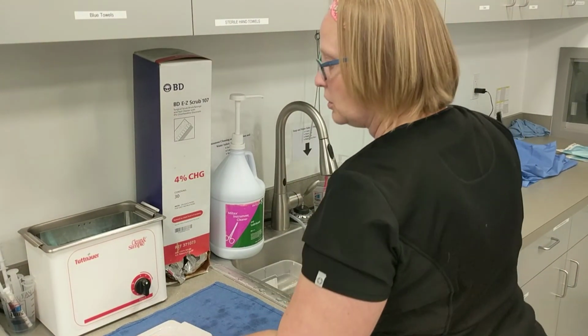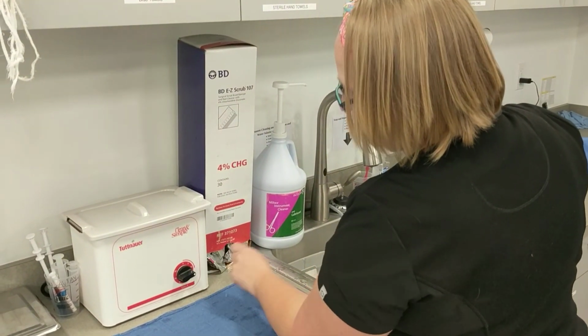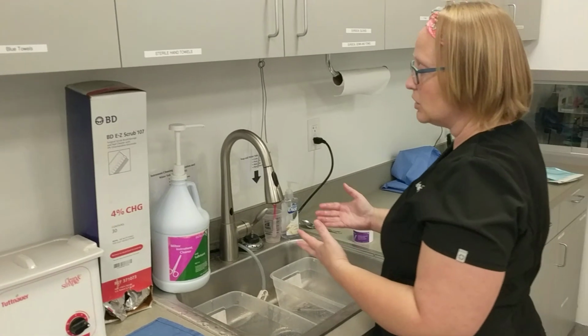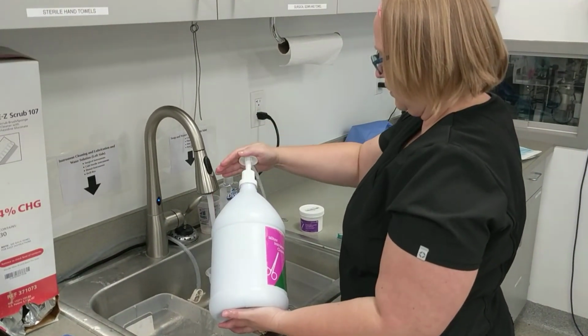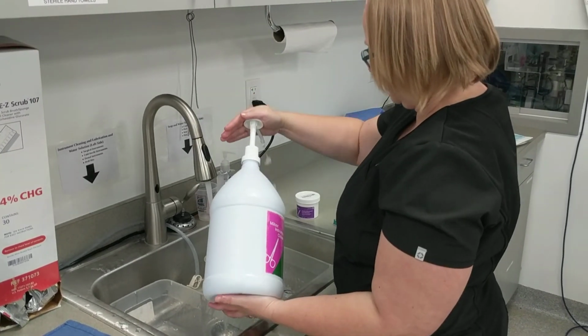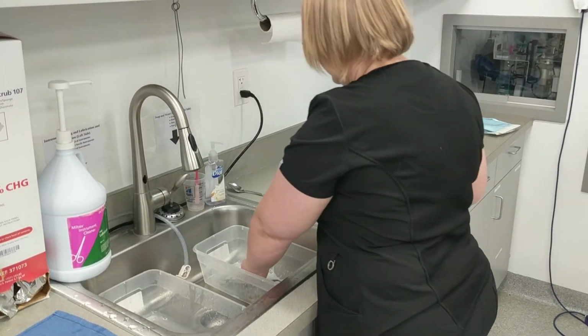From here, I'm going to go ahead and put the lid back on. We're going to set this timer to 10 minutes. That's going to run. What I'm going to do next is use 2 pumps of my instrument cleaner and lube.